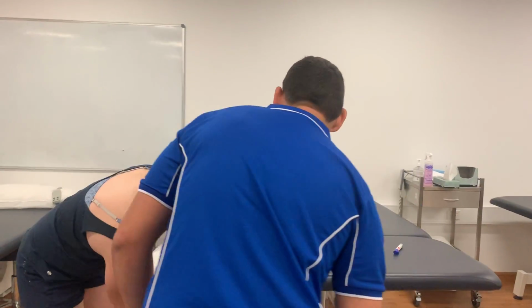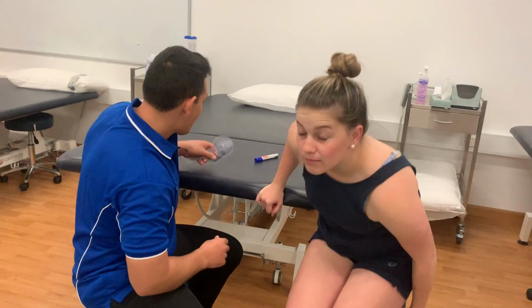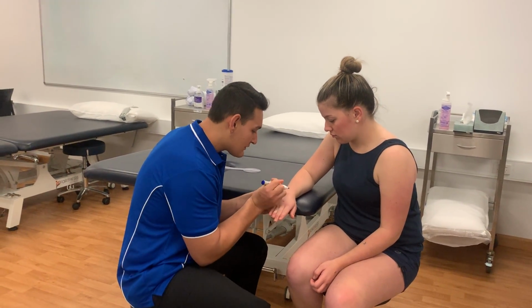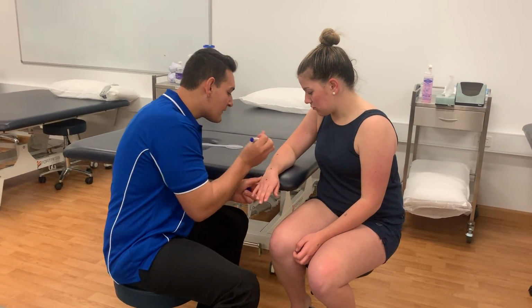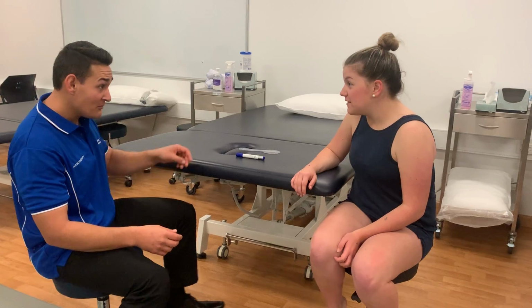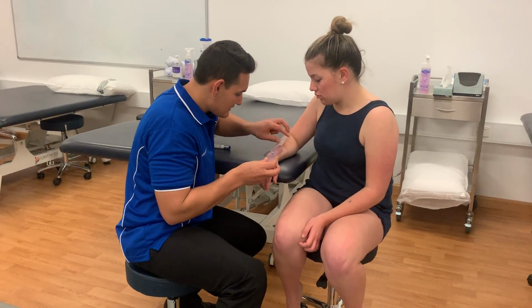So if we just switch over sides here. Okay, so again, we're going to mark out the same points on this arm, Simone, so we get that perfect, accurate measurement. That one there, and that one there. Just before, Simone, I didn't ask you, would you feel more comfortable with draping? You're okay? Are you sure? Yeah. Okay, that's great. Thank you. Alrighty, so we're going to get this one over here.